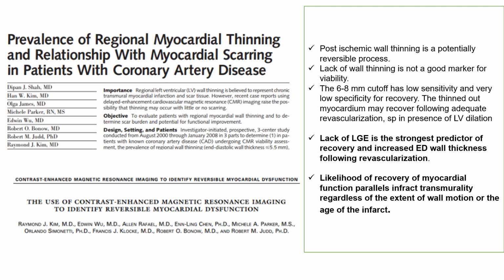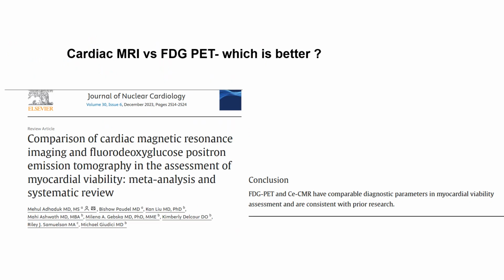The lack of LGE is the strongest predictor for recovery and increased end diastolic thickness following revascularization, and the likelihood of recovery parallels infarct transmurality, regardless of the wall motion anomalies and regardless of the age of the infarct.